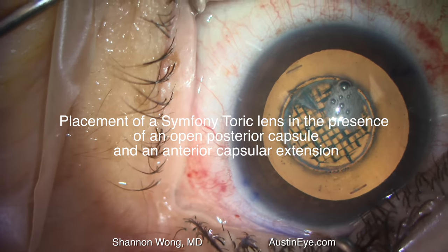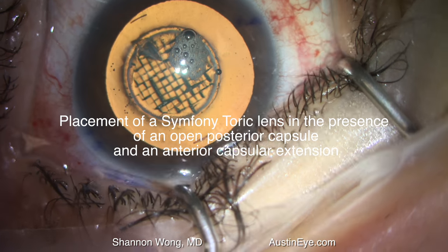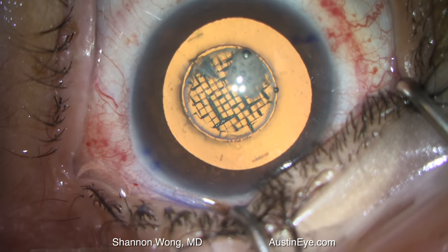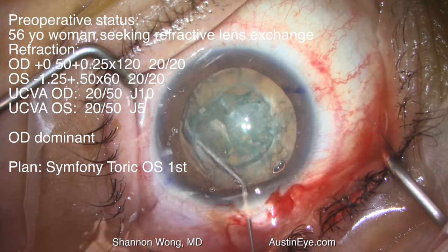This is Shannon Wong in Austin, Texas. I'm going to present this interesting case of an open posterior capsule that occurred with a planned placement of a symphony toric lens implant.